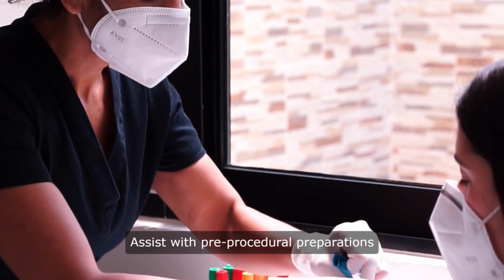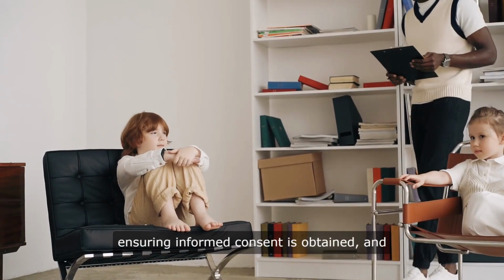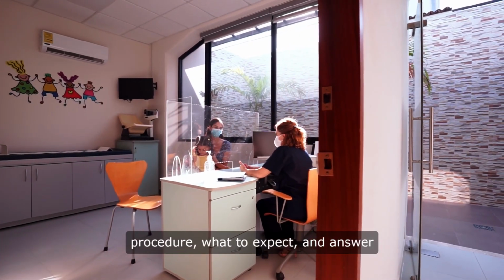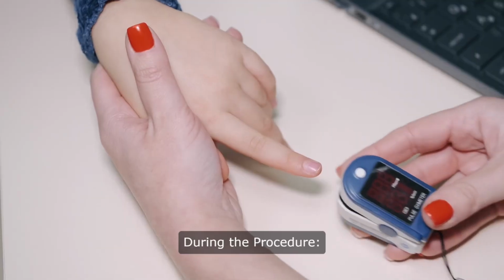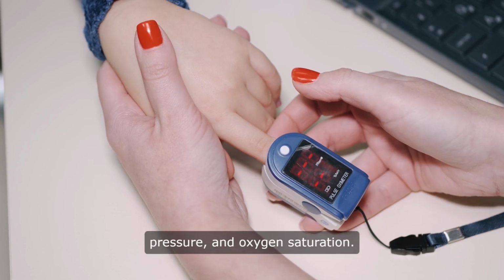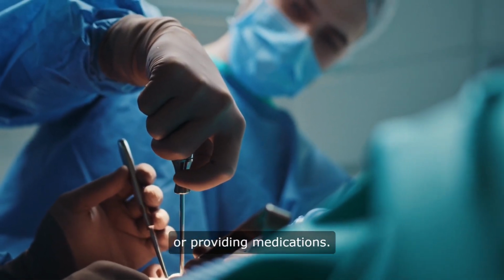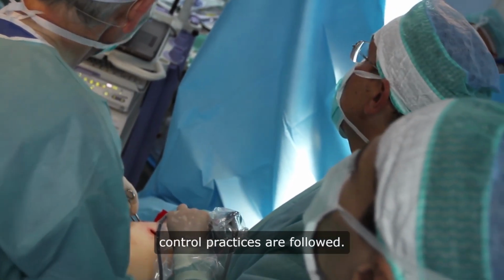Assist with pre-procedural preparations, such as administering medications as ordered, ensuring informed consent is obtained, and preparing the child and family psychologically. Educate the child and family about the procedure, what to expect, and answer any questions or concerns they may have. During the procedure, monitor the child's vital signs, including heart rate, blood pressure, and oxygen saturation. Assist the physician during the procedure as needed, such as handing instruments or providing medications.